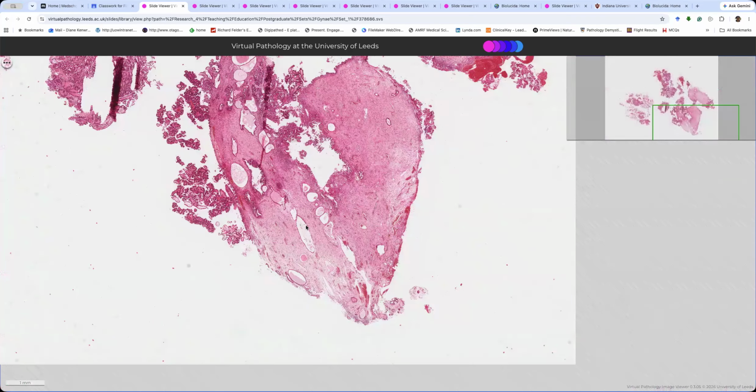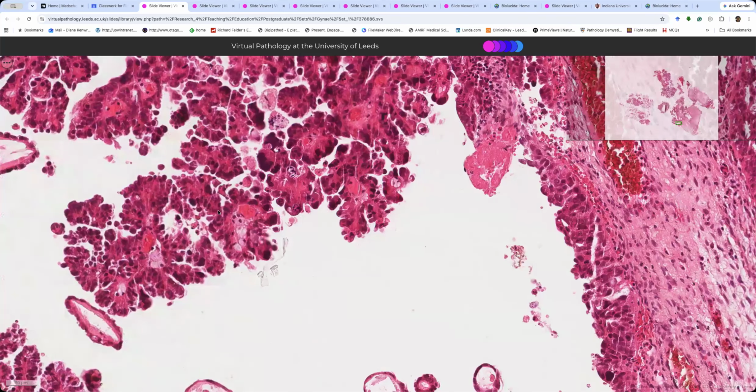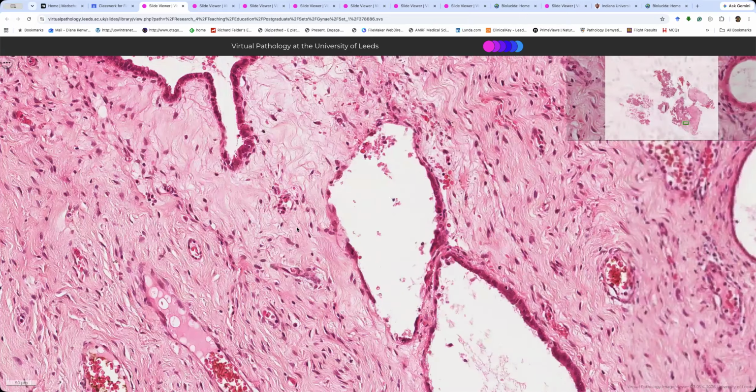Okay, so polyps in young women that are looking normal, I'll go over it 10 times. If I see any hyperchromatism at all, I will be down there looking. But polyps in old ladies, I really, really examine hard. And we can see that it's got the horrible nuclei of serous and it's showing papillary. But here we've got it in situ starting in this polyp. It's really important.